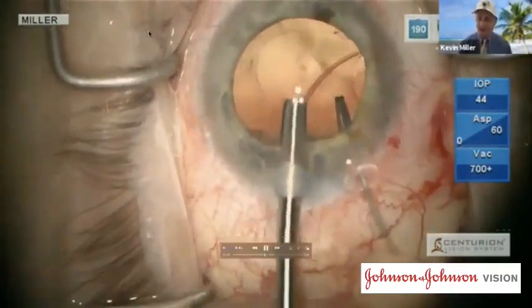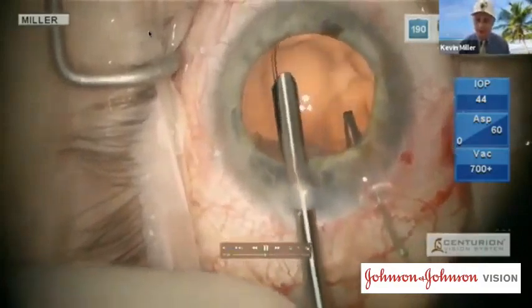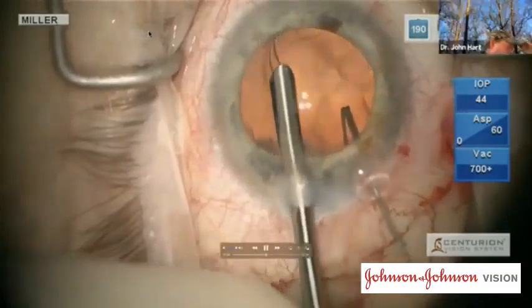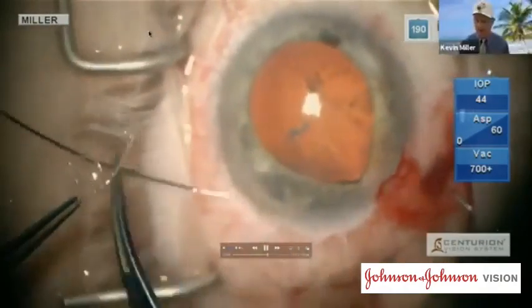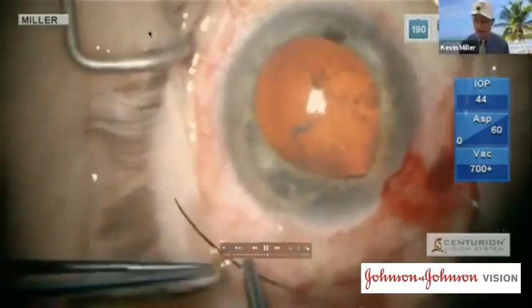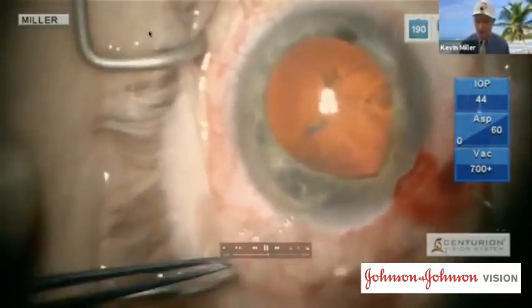The next device to use is a capsule tension ring. I like to put them in with inserter devices, but you can use forceps if you like. Now comes the capsule tension segment. I've already passed the suture through the Hoffman pocket beneath the iris and out through the incision.